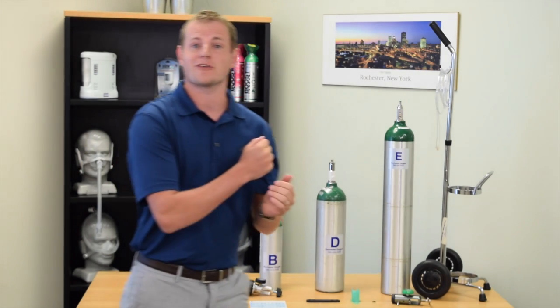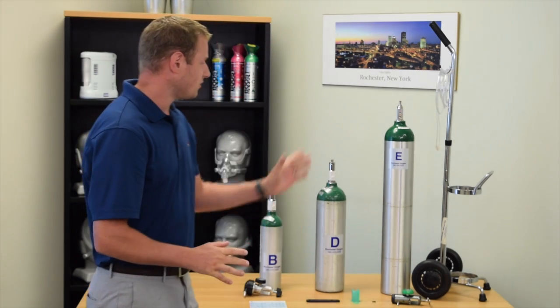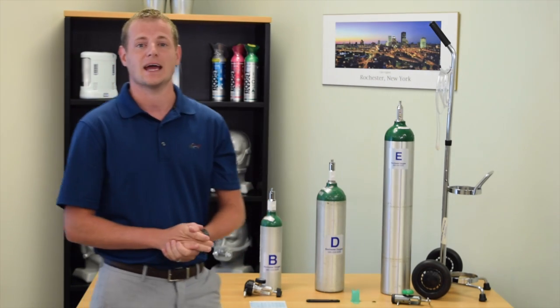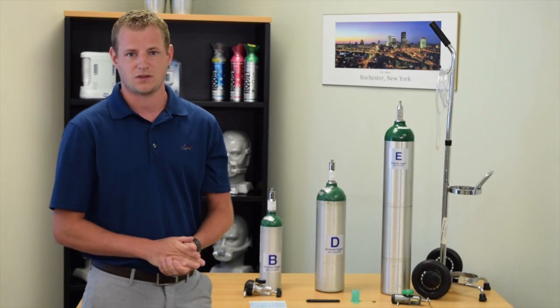Oxygen tanks come in a variety of different sizes and types. You can see in front of us we have an E tank, a D tank, and a B tank, which is commonly referred to as an M6 tank.